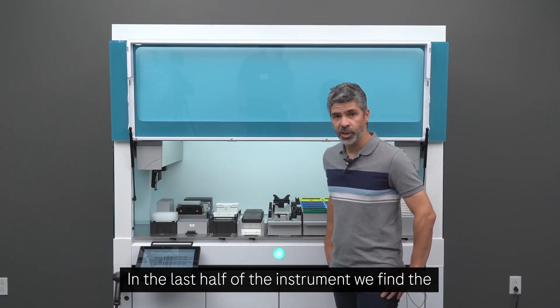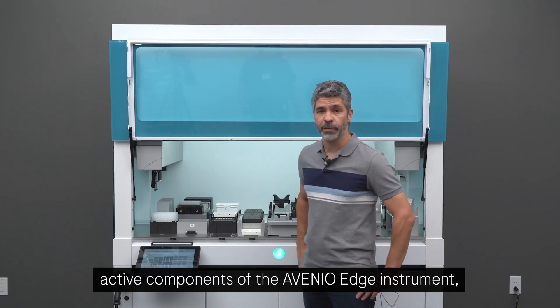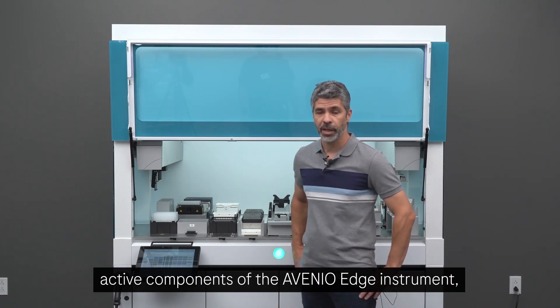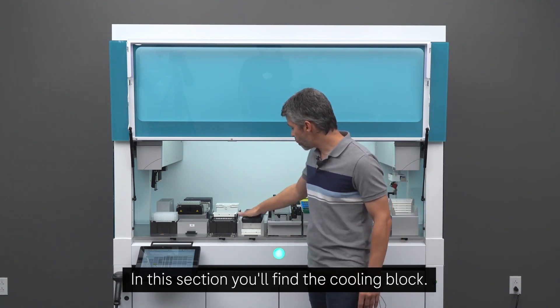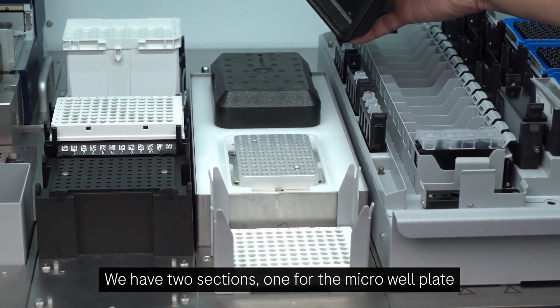In the last half of the instrument, we find the active components of the AVENIO Edge instrument where most of the process is performed. In this section, you'll find the cooling block. We have two sections.